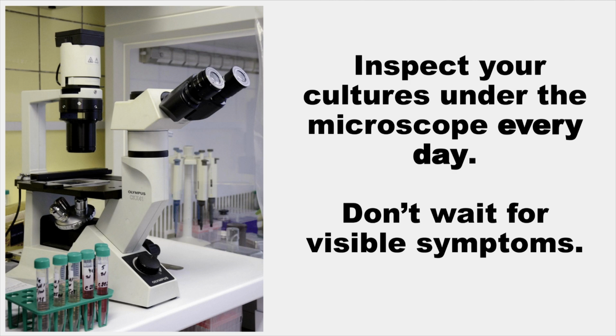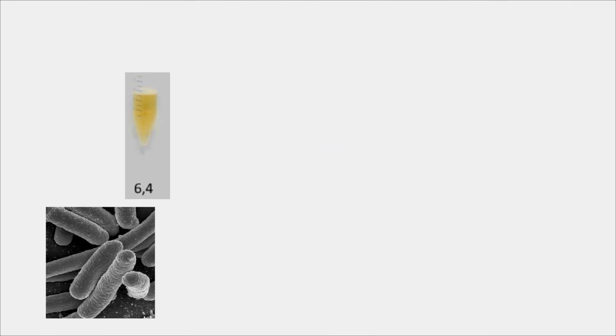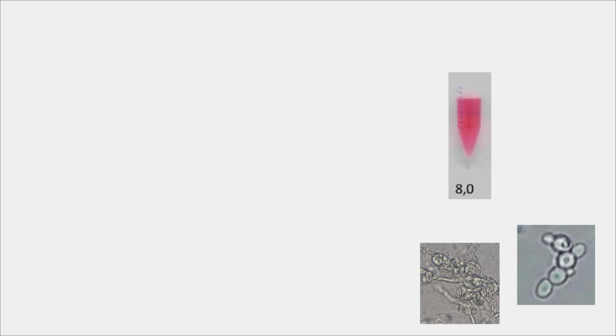Check your cultures daily. Don't wait for visible symptoms to show. Microbes change the medium's color. It turns turbid and may smell. And under the microscope, you'll spot tiny moving particles. When the medium turns yellow, it indicates bacteria. When it turns pink, it indicates fungi or yeast.